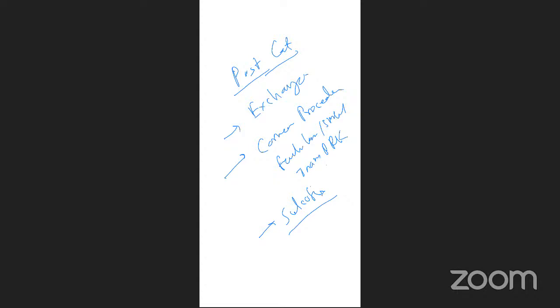Sir, recently means up to 2 or 3 months? Recently operated means the time period is up to 3 months or 6 months? It depends on lens to lens. Some of the hydrophilic lenses, they don't stick to the capsule. So in that case, even after 2-3 months also we can try to remove. The major issue in that is fibrosis around the haptics. The optic itself is not sticking to the capsule. For hydrophobics, generally first month is easier. After that, it becomes a little bit difficult.